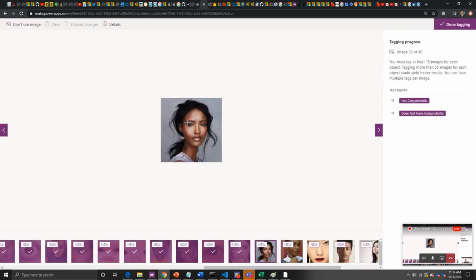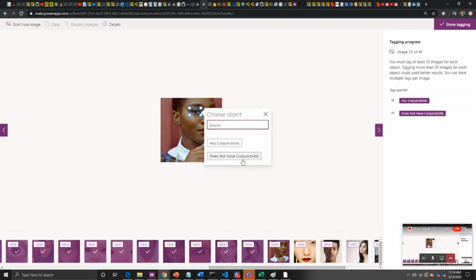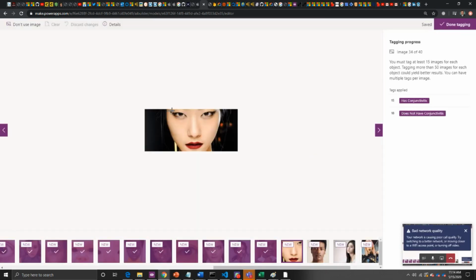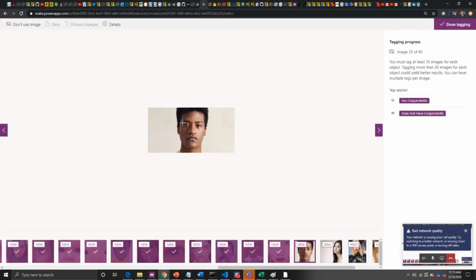Now, I haven't really tested these eye functions using only pictures that don't have makeup, for example. Women use a lot of eyeshadow and different kinds of eye makeup, and I'm not 100% sure if that's having an impact on any of these. In other words, if I was using this in a clinical setting, would I have to tell the patient, look, when you take this picture, don't have any eyeshadow? But predominantly, the system will recognize that what I'm trying to test is really what's within the eye, as opposed to what's around the eye.